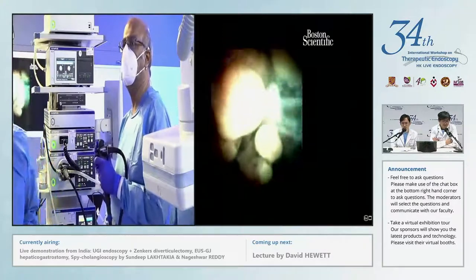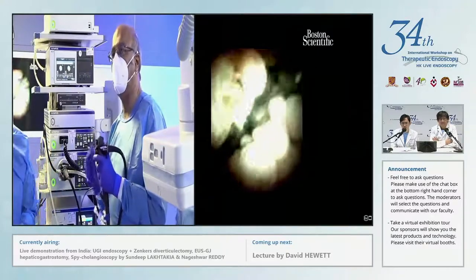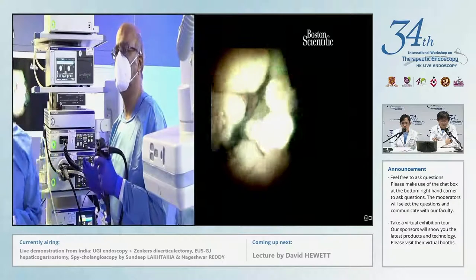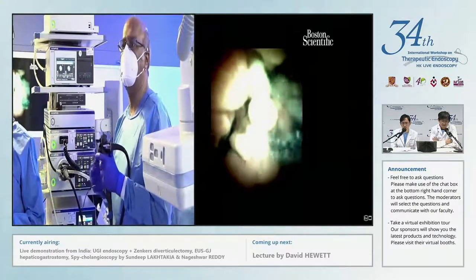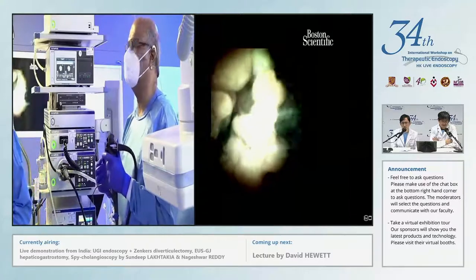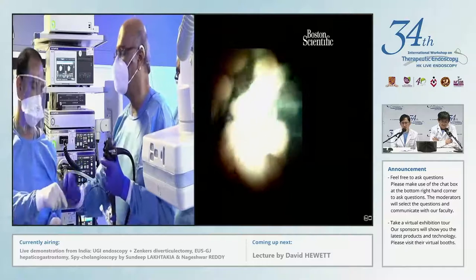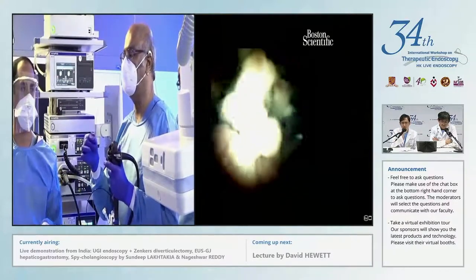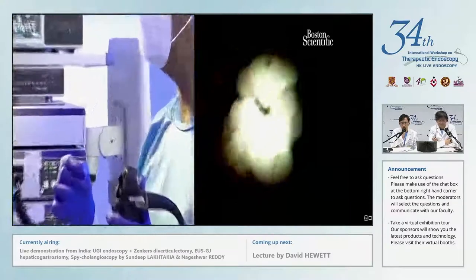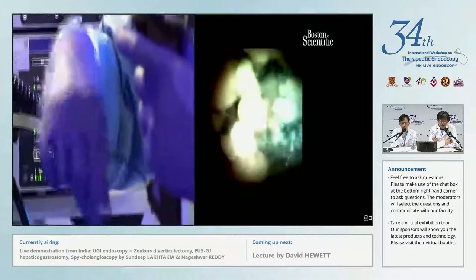I'm going to use a SpyBite, a rather costly way. In fact, one of the things we do in a non-workshop situation like this is use this and then take a biopsy with standard biopsy forceps, because you'll get a good piece in this case. You don't need to use the SpyBite, because it's going to give you a small bit. This is a SpyBite biopsy forceps, with 4 millimeter jaws. They're trying to improve on this. I'm going to use that. Can you open, close?